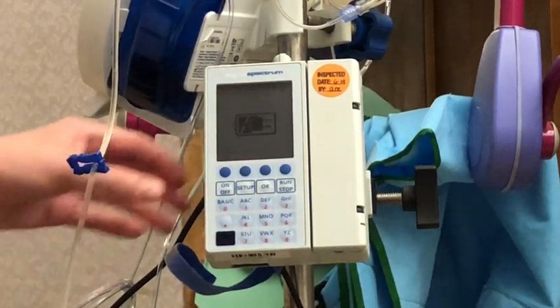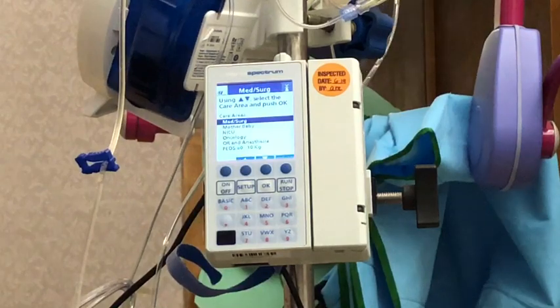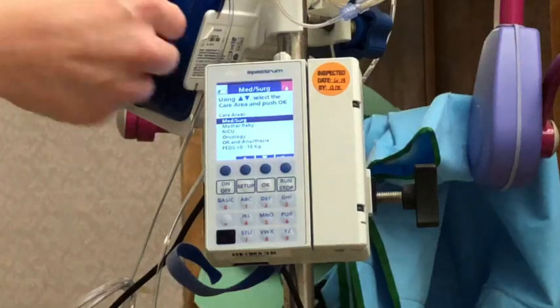To start, the first thing I want to do is turn the pump on, and I can do that by pressing this on/off button right here. That's going to wake the pump up, and then I can load my tubing.